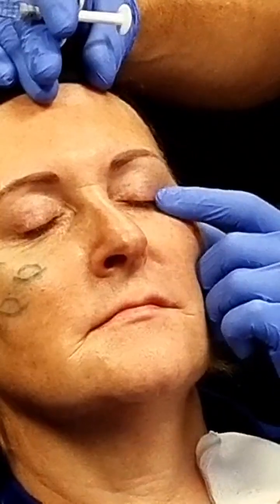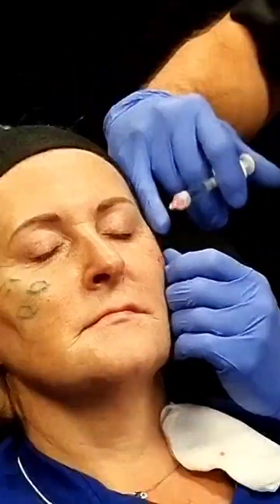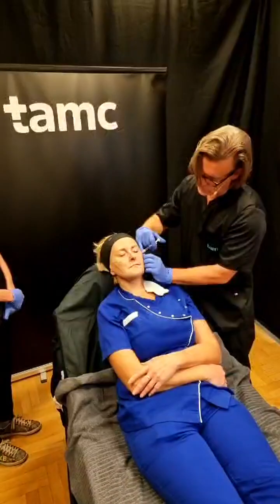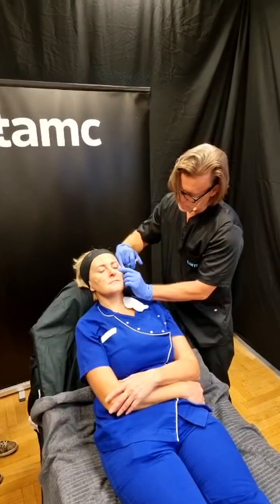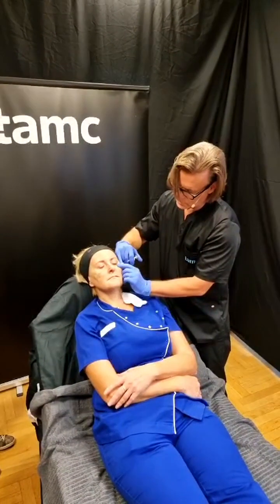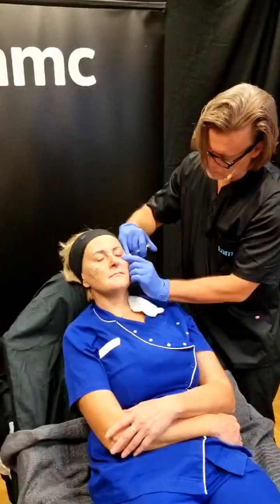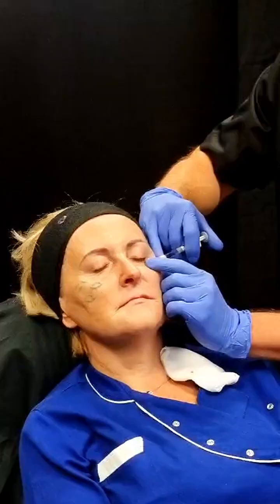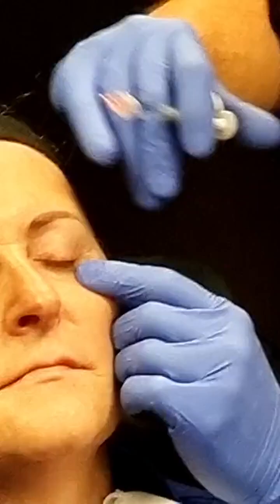I'm going to do the same trick here. Here you feel fat, there is orbital rim, there's nothing in between. Let's go in between there. So it's constant monitoring of the needle tip. And putting 0.05.